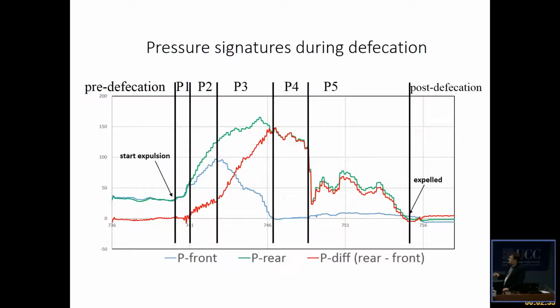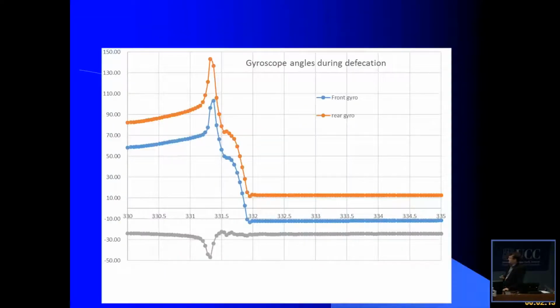This healthy subject here actually had some problems expelling the device completely, so he was still sitting in the anal canal, and he had to make 3 contractions before it was fully out. This is not what we see normally. Normally phase 5 would be quite a lot shorter. But it shows some of the potential with this kind of pressure measurement.